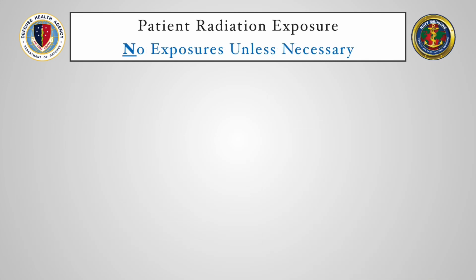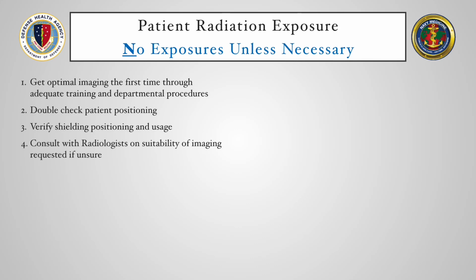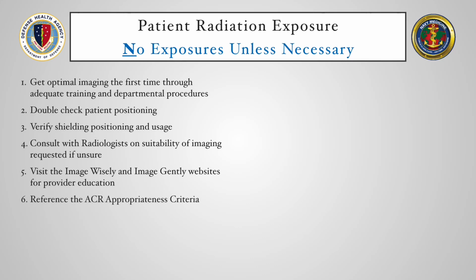Radiation exposure to the patient should not occur unless it's clinically necessary. There are multiple things we can do to reduce unnecessary exposures. Get optimal imaging the first time through adequate training and departmental procedures, for example, PQS, Personnel Qualification Standards. Double check your patient positioning. Verify shielding positioning and usage. Consult with radiologists on suitability of imaging requested if unsure. Visit the Image Wisely and Image Gently websites for provider education. And finally, reference the ACR appropriateness criteria.